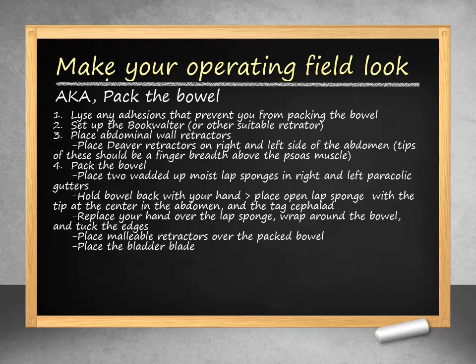After our exploration is complete, we should prepare our operative field for adequate exposure to the pelvic structures. Any adhesions that prevent you from adequately packing the bowel should first be lysed. Next, the Bookwalter retractors should be placed. Abdominal wall retractors should be placed on the left and right sides of the incision. Now the bowel can be packed — each surgeon has their preference, but we prefer first packing a wadded-up moist lap sponge in each pericolic gutter.